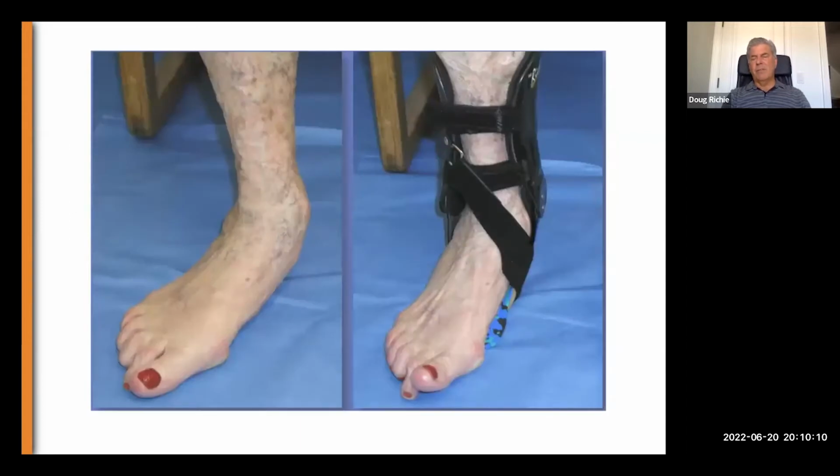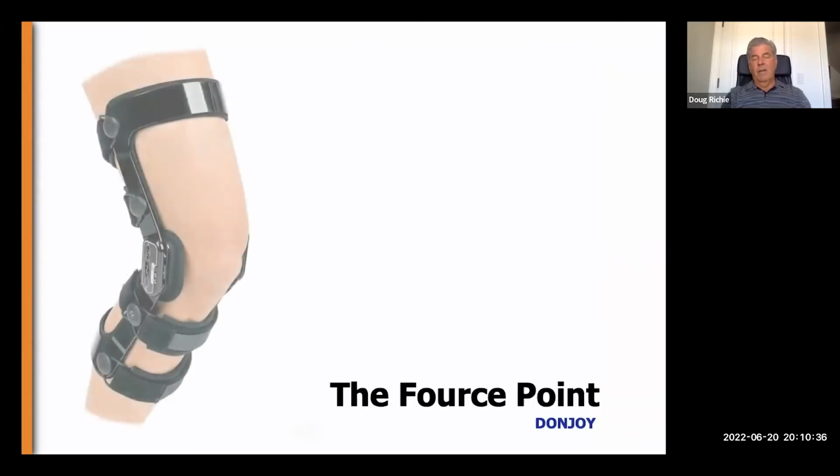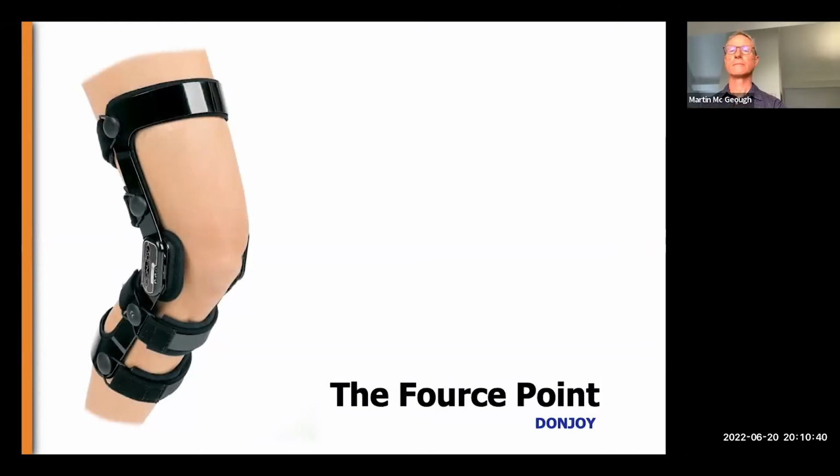And it's that principle that we use with the Richie brace, and as we talked about the adult acquired flat foot in the previous webinar. And using this principle of tight affixing of the brace members to the skin and to the anatomy, we can control rotation. We can control transverse plane rotation of the tibia, and we can control frontal plane motion of the subtalar and ankle joints. This is the same concept that we see in these very high-tech knee braces that are worn by collegiate and professional athletes.